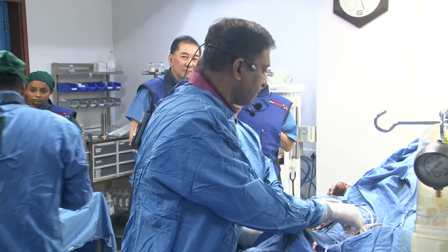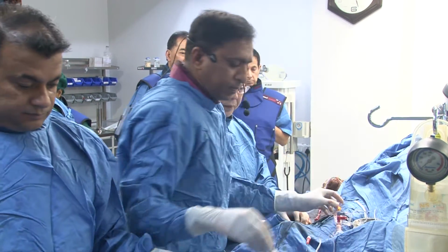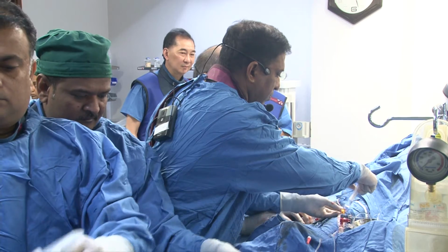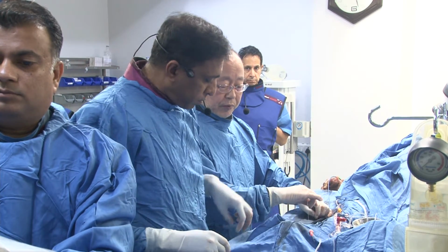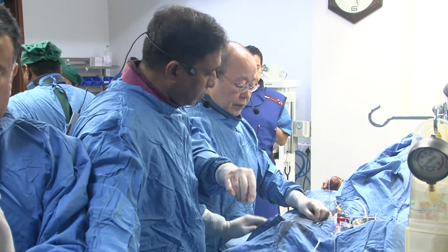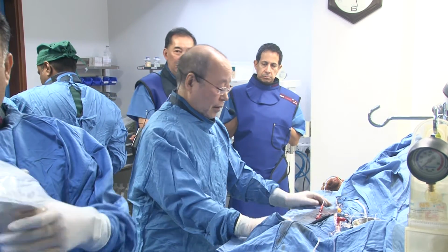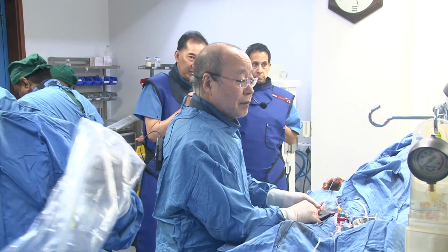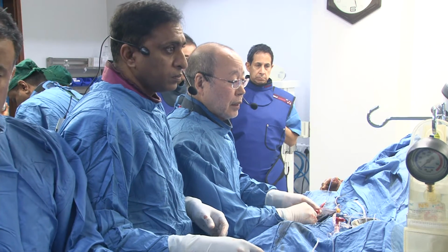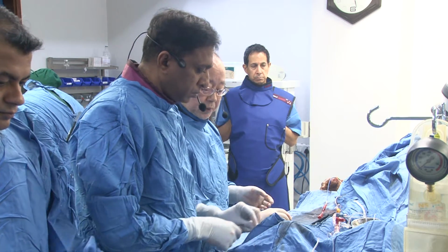So perhaps at this stage you could explain to the audience what you're looking for with your intravascular imaging. Because I think many people here would just put another balloon and inflate, but we would like to learn from you what you're looking for with OCT here. I want to remove this one. So Dr. Saito, the panel asked you, what are you looking for from the intravascular imaging? You're looking for calcium, the lesion length, what else? I think there should be some calcium, not so much, but some calcium.